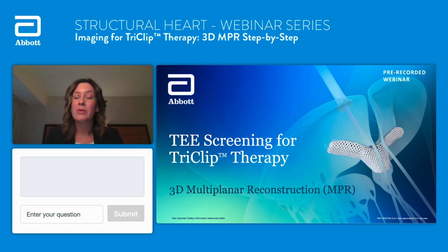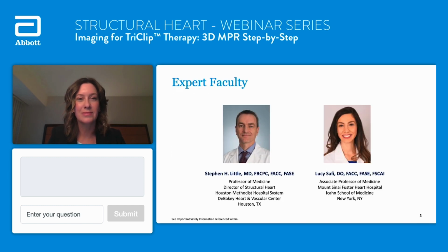Today we will continue our series on imaging with a deep dive on a critical skill for TriClip imaging, 3D multiplanar reconstruction. We have brought back our imaging experts from two highly experienced centers for this topic. I'm pleased to reintroduce them.